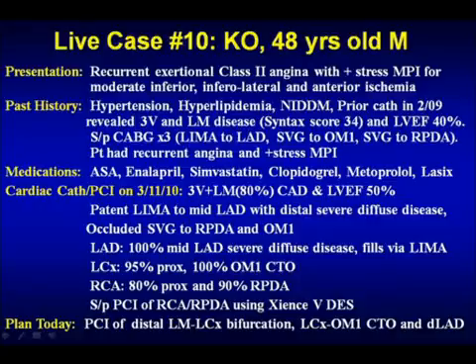That time we decided, because the patient now within just a year after CABG came with the symptoms, that we did a PCI of the RCA and RPDA with the Zions V stent. And the plan was to bring the patient back for the remaining vessel intervention.